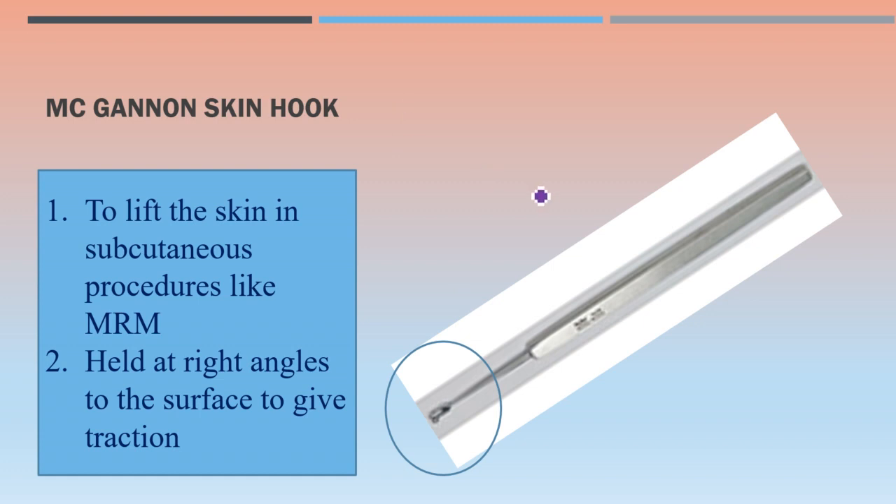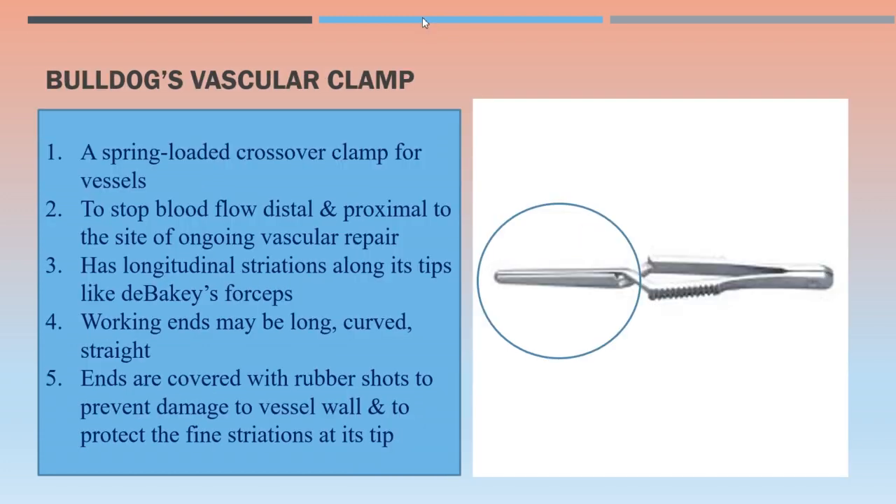This is McGannon skin hook, used to lift the skin in subcutaneous procedures like modified radical mastectomy. This instrument is held at right angles to the surface to give traction.